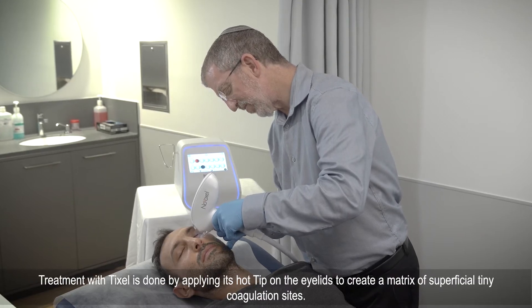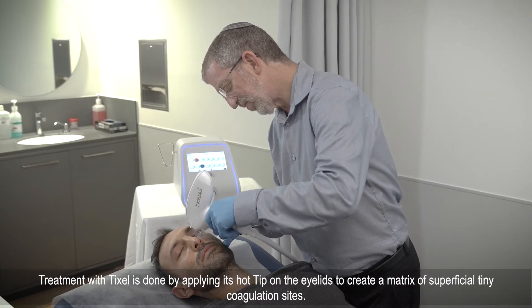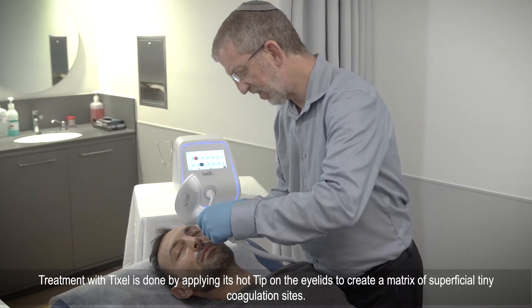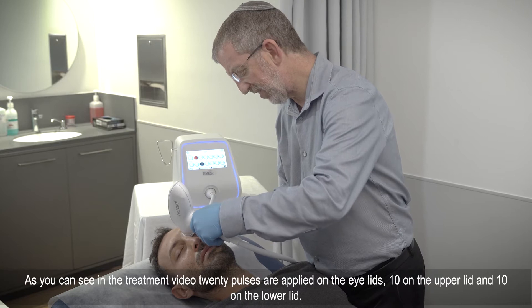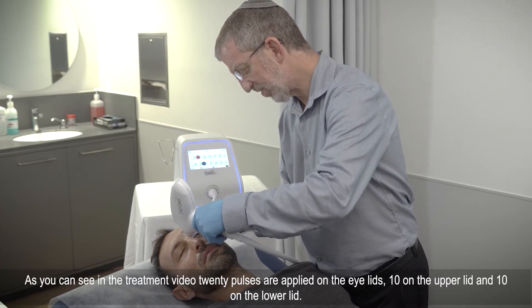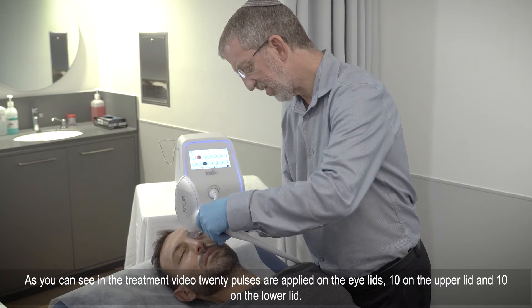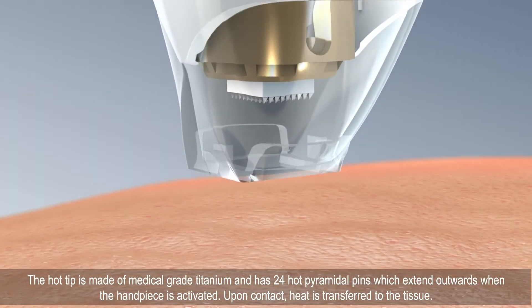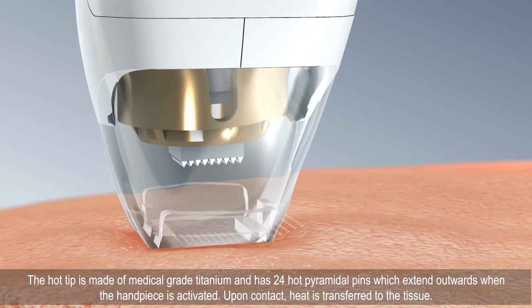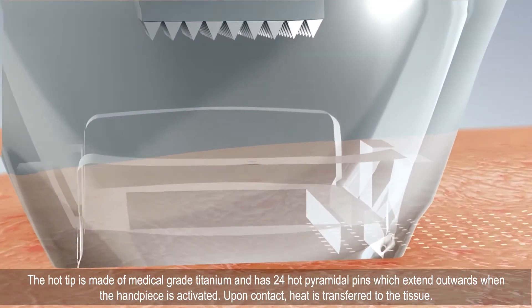Treatment with Tixil is done by applying its hot tip on the eyelid to create a matrix of superficial tiny coagulation sites. As you can see in the treatment video, 20 pulses are applied on the eyelids — 10 on the upper lid and 10 on the lower lid. The hot tip is made of medical grade titanium and has 24 hot pyramidal pins which extend outward when the handpiece is activated.